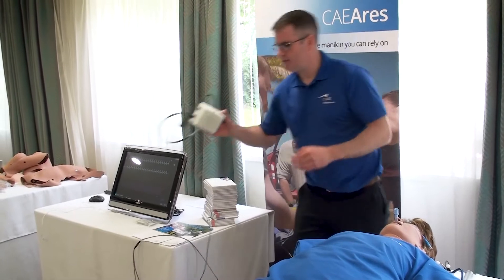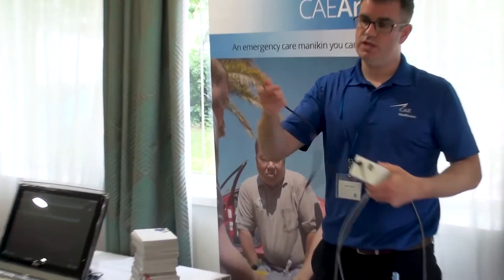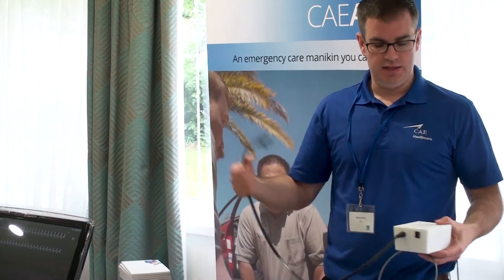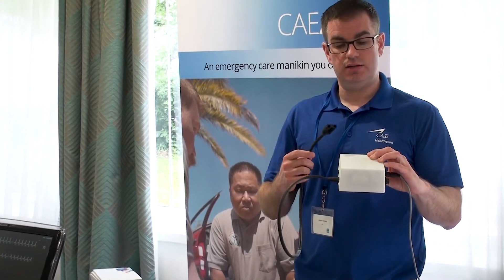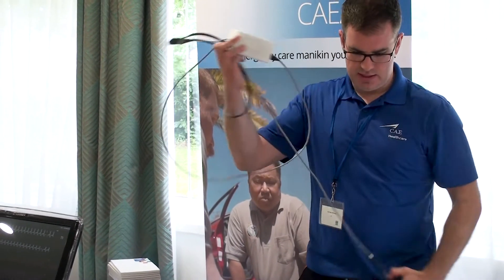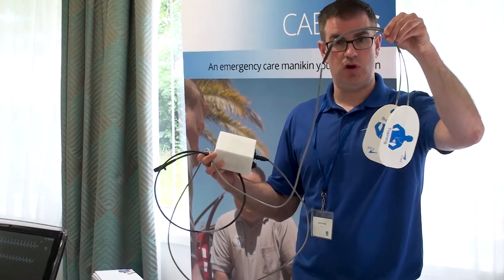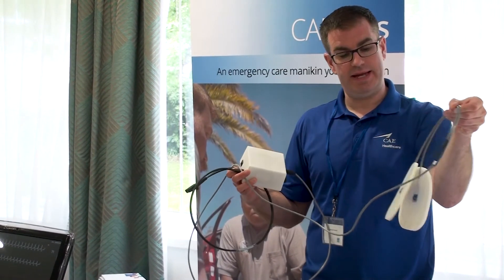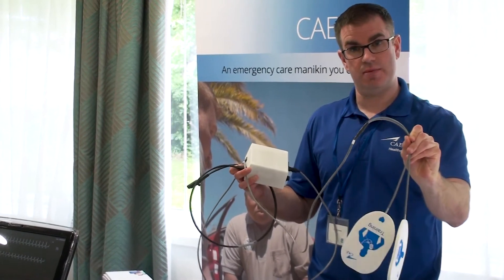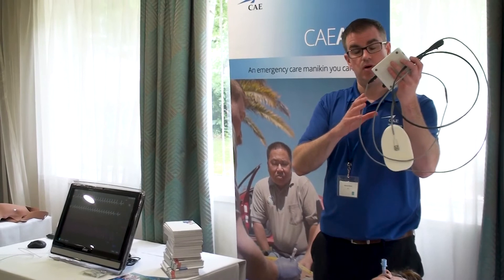Also when defibrillating the mannequin, we've moved away from studs. We now have an external kit — you plug this into the defibrillator, and this box takes the shock so it's not actually going through to the mannequin. We then place these pads onto the mannequin. These are not consumable; they last for a long time and aren't sticky — they have magnets on the back so they sit onto the mannequin. That deals with all your issues about connection and pads popping off.